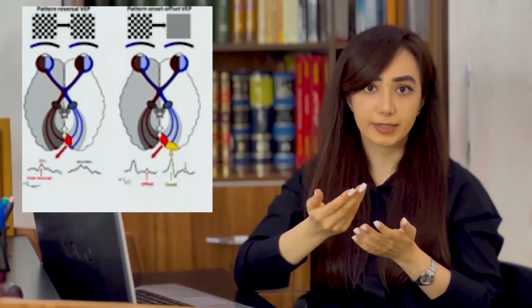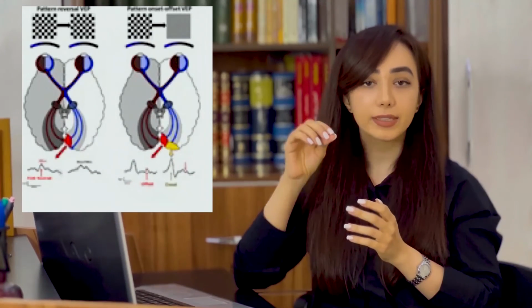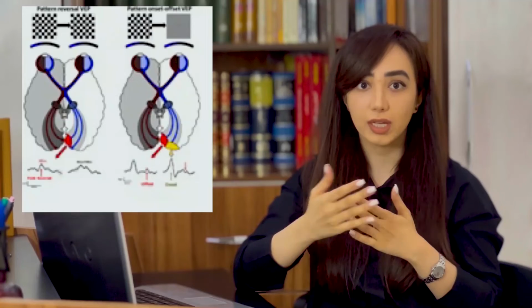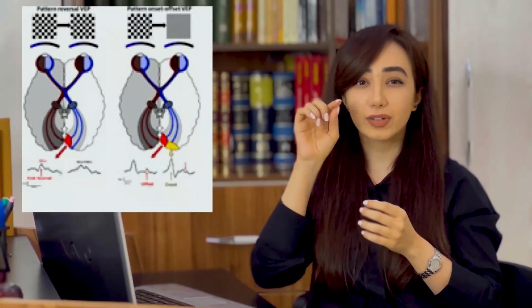Throughout such experiments, as you can see here, we exhibit an animated checkerboard on the screen, and the subject, who sits in front of the screen in a comfortable position, has to focus on the red point displayed in the center. Also, we have to know the human brain is designed to be very sensitive to faces and can distinguish them considerably faster than other objects.